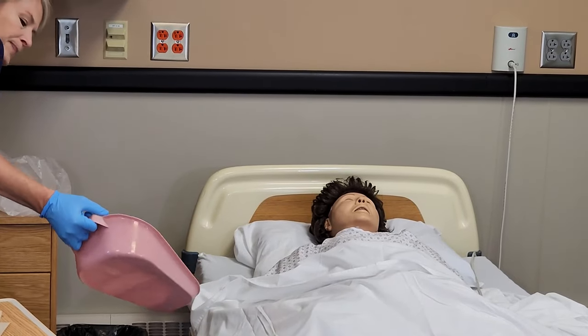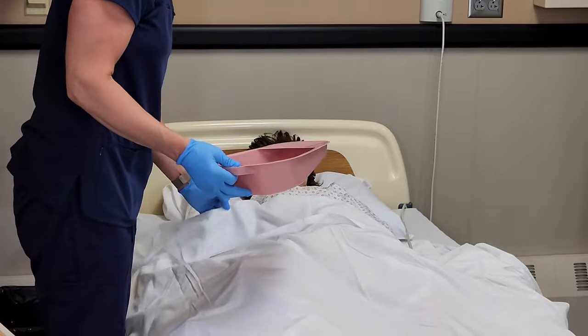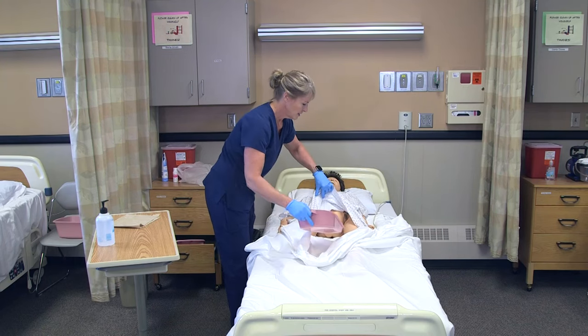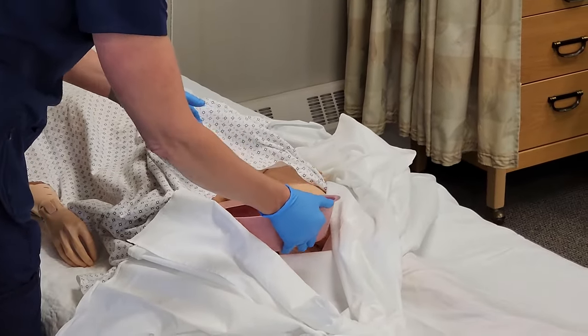For the video, we'll use the fracture pan. 'Annie, I'm going to have you lift up your hips and I'll place the pan underneath you.' I would have her raise her bottom up and put the pan underneath.